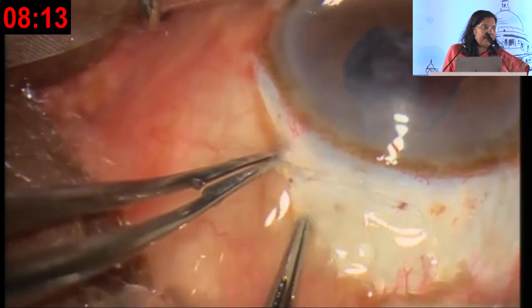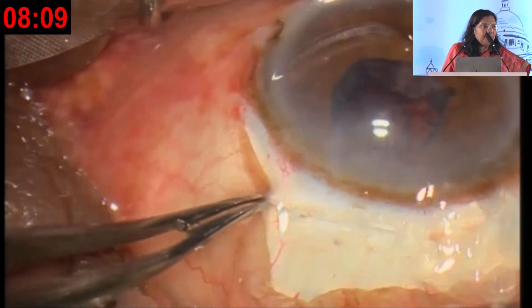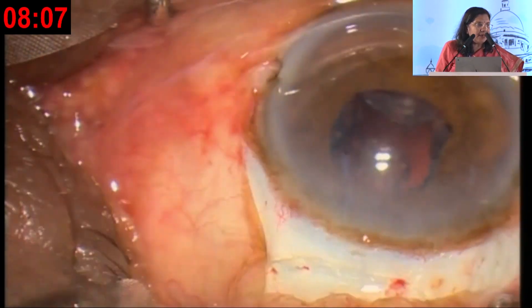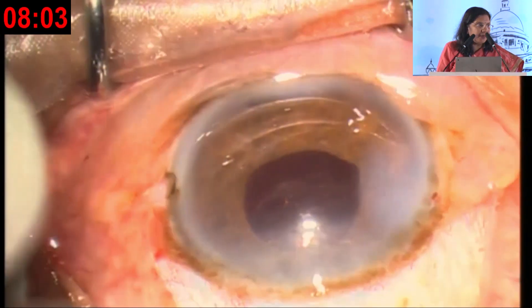Dipping the sclera slightly also helps to remove the epinucleus. With the help of a single-port aspiration cannula and the AC maintainer, complete cortical removal can be done, and then the IOL can be put inside the bag.